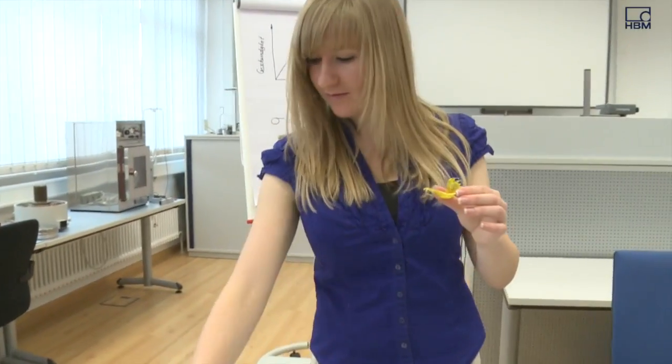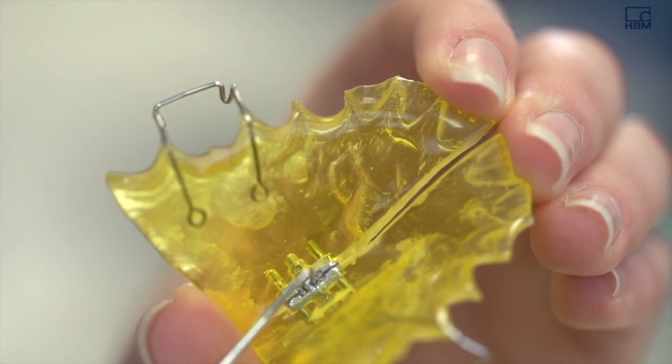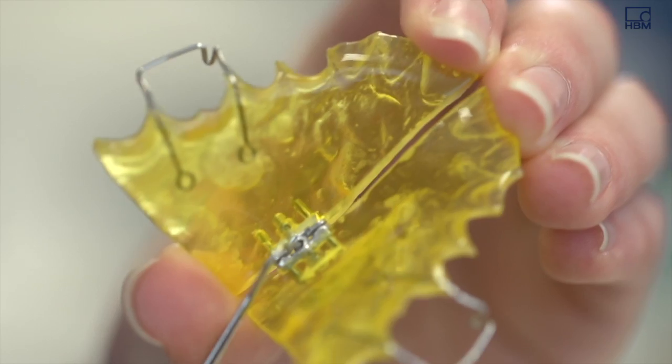Currently, there are no scientifically based specifications on how much and how often the expansion screw needs to be tightened. There is some experimental evidence that suggests the expansion screw should be tightened approximately every two weeks.